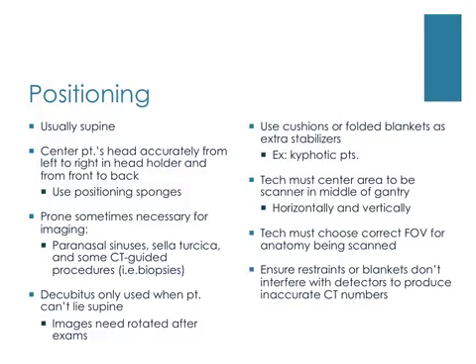This also can come into play if your CT machine has a safety feature where, for example, I know that our CT scanner that I work on has a safety feature that actually shuts down the scan. It completely stops the scan if anything touches inside the gantry. So, for example, if we have a patient on a backboard and they're a larger patient and blankets and restraints and all kinds of things go through the gantry during the scan, if one of them touches the inside of the gantry, then it stops, and the scan actually has to be started over once we reposition everything.